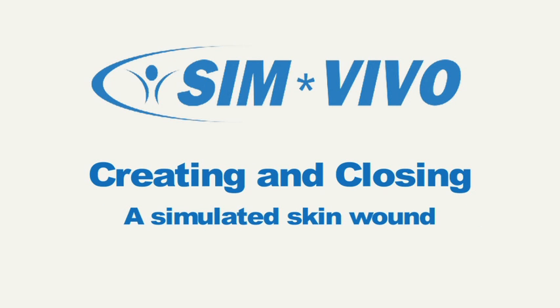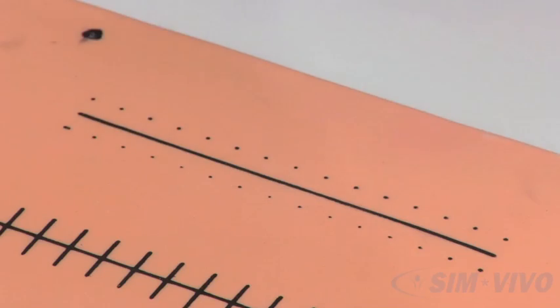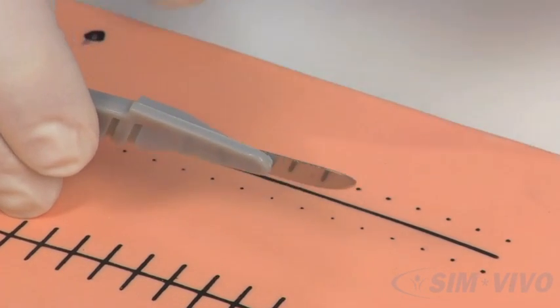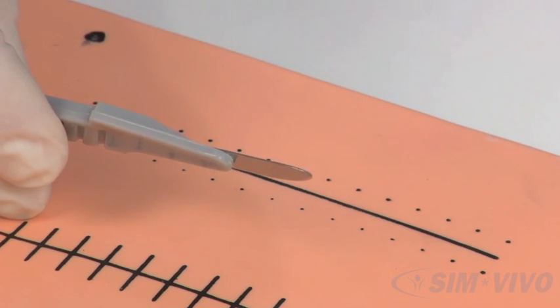Now, let's create and close a simulated skin wound. To make an incision, we are going to use the scalpel with a number 10 blade, the large one. Hold the scalpel in your dominant hand, like a violin bow. We are going to incise the lower left line with a dot on either side.